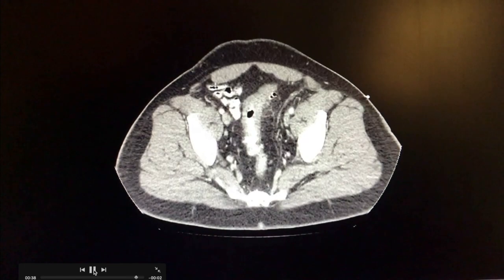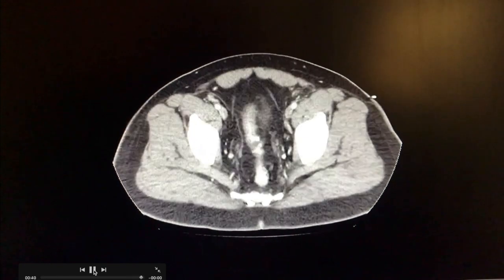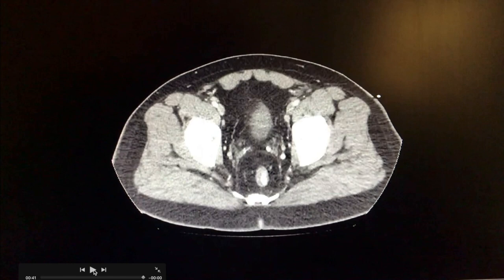Hopefully this will make you feel a little more comfortable as you start supporting some of the biopsy and drainage procedures that are performed in the CT lab.